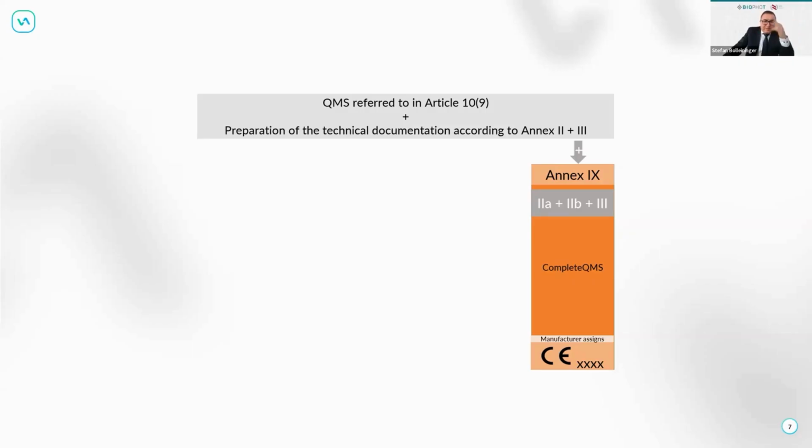So, going back into the conformity assessment, you have two pathways for medical device software. Either you go Annex 4 for Class 1 devices, or you go Annex 9 for 2A, 2B, and Class 3 devices. You can use the other annexes for the certification, but I don't recommend that for you. I really don't recommend it, because in the long run there will be a lot of burden, and that's the better one. So let's go back on that.